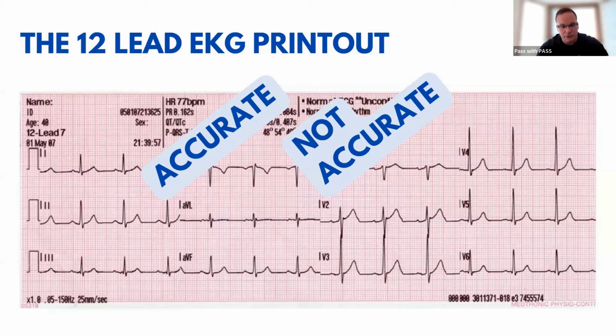And to give you a really recent example of that, in my full-time position with Hebron Fire as a captain of EMS there, doing QA, yesterday I took about 10 days off for the holidays. And when I got back in and started doing QA, one of our medics asked me about a run they had and to do a follow-up with STEMI. So I started looking at this guy's 12 lead, and the printout said he was in sinus brady at a rate of 38. The guy was in SVT or AFib with RVR, we're waiting to get a follow-up, at a rate of well over 200. So that information is not always going to be correct.